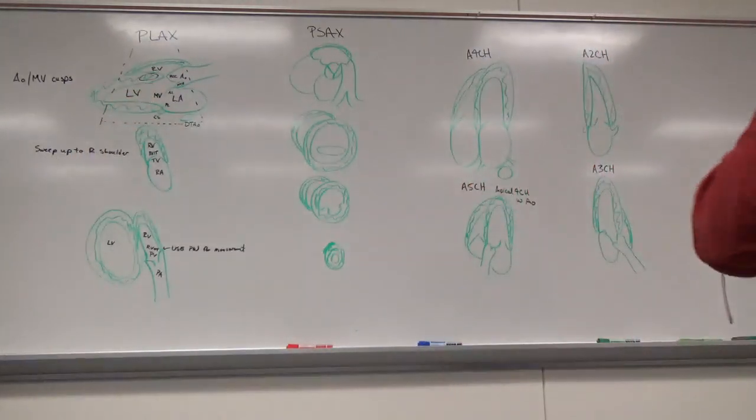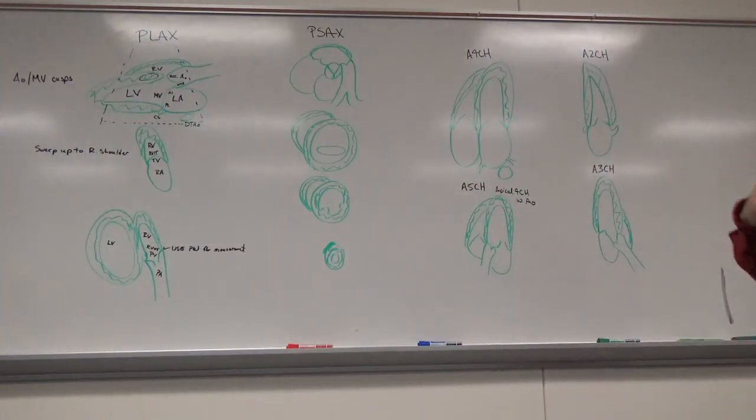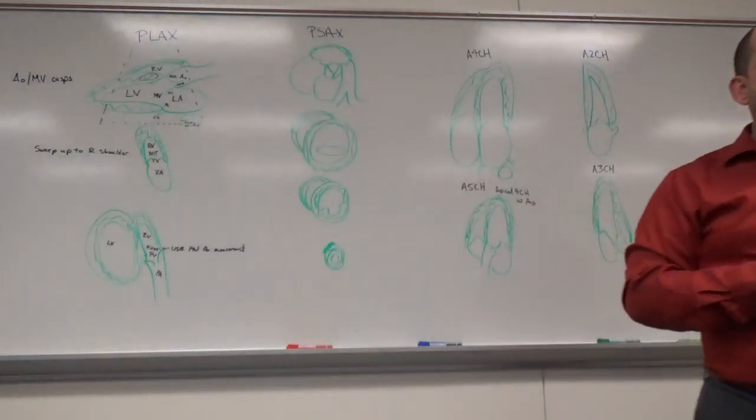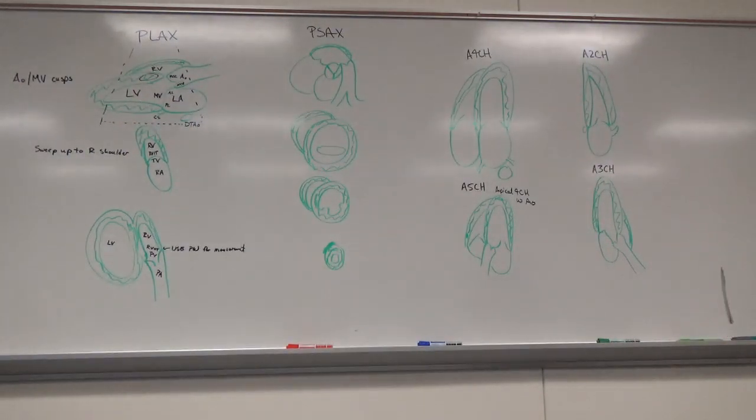It becomes compacted and smooth because you want to have a nice smooth transition of the fluid going out. So just anatomically, that's what you'd see. In the atria, right atria we talked about in particular, the back side of it is smooth and the anterior aspect is pectinate muscle, which is similar to the idea of trabeculated muscle that's in the ventricle.